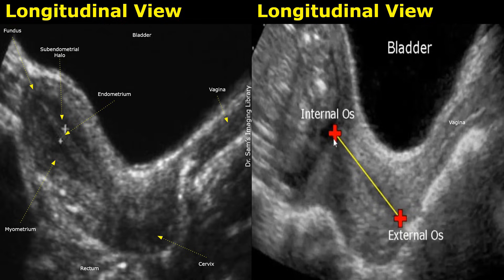Hello everyone, this is Dr. Sam and today we will learn Gynecological Ultrasound Anatomy. Today we look at the normal ultrasound anatomy of the uterus and the adnexa. We will study labeled ultrasound images in both transabdominal and transvaginal approaches.